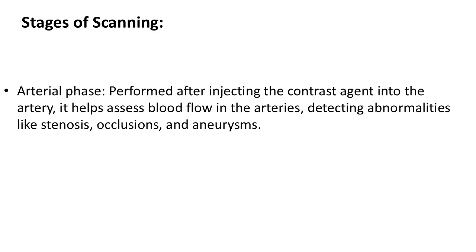Stages of scanning: arterial phase performed after injecting the contrast agent into the artery. It helps assess blood flow in the arteries, detecting abnormalities like stenosis, occlusions, and aneurysms.